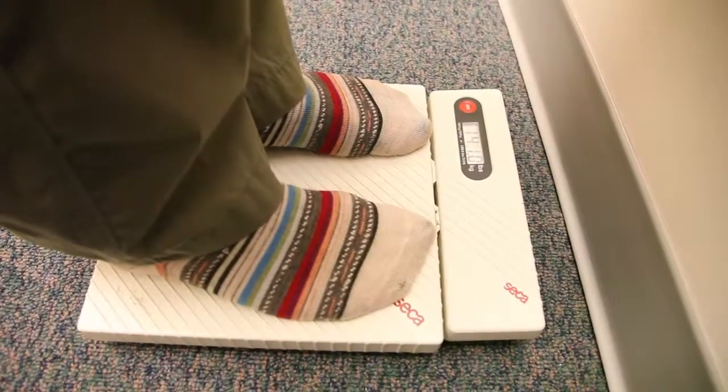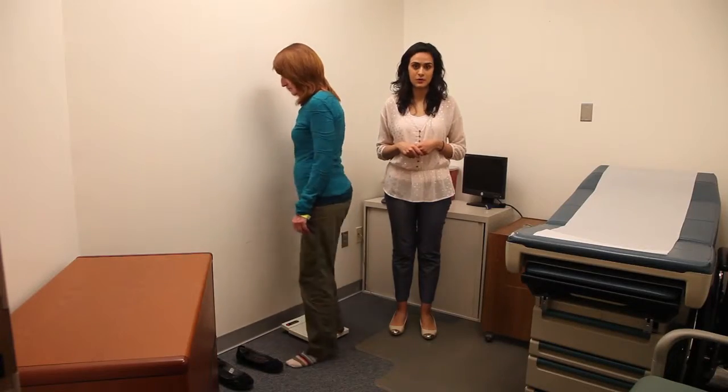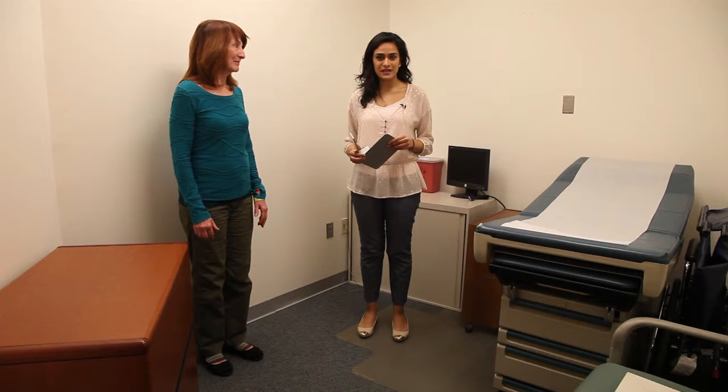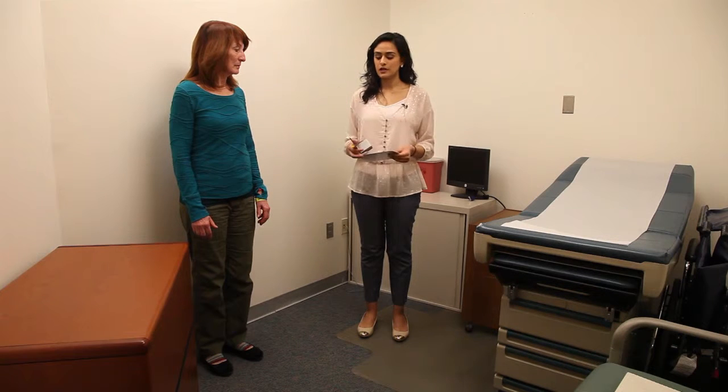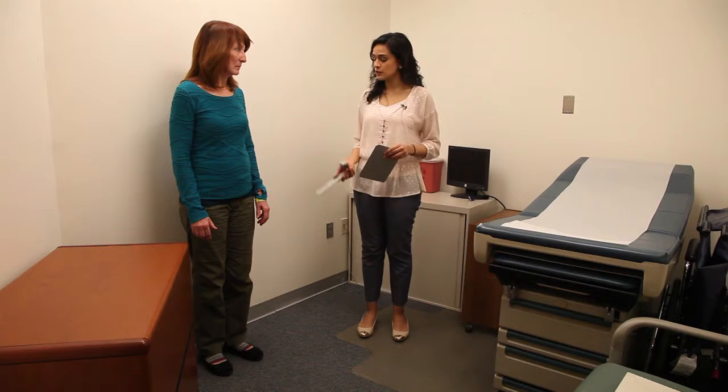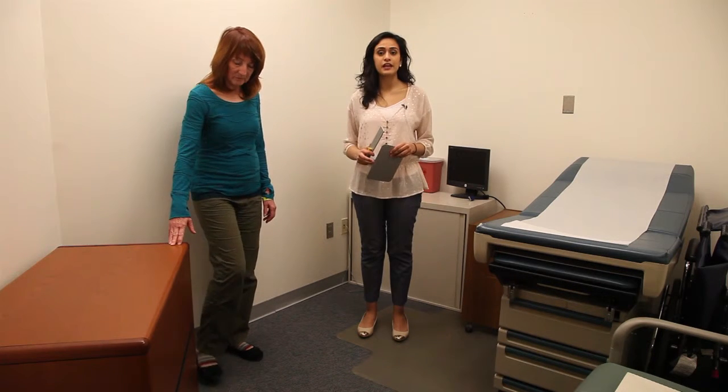We have now generated a reading, and so we can move on to the height component. We are now going to move on to the height measurement component. In this measurement, you will need a stadiometer where you can measure your patient's height. Also, please ensure that the patient removes their shoes once again to get an accurate reading.